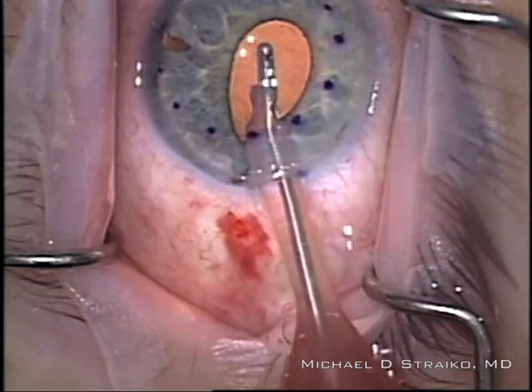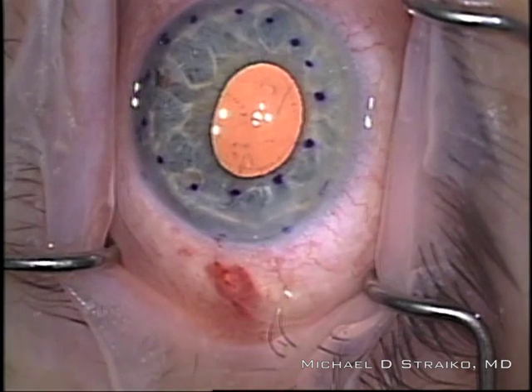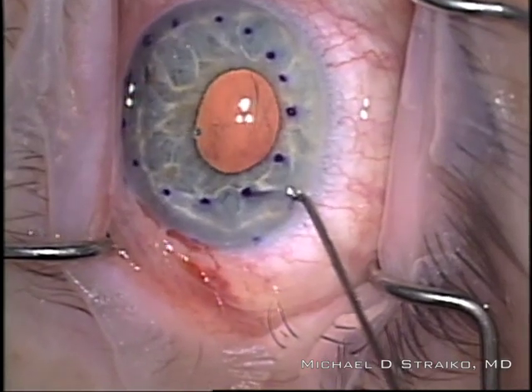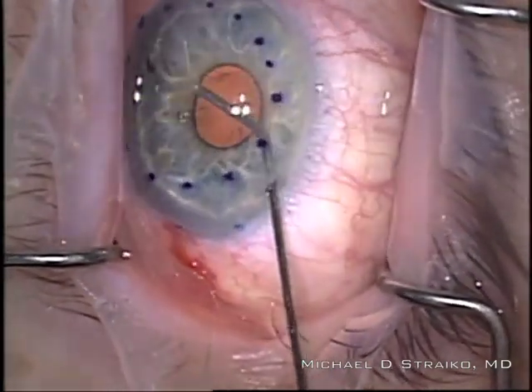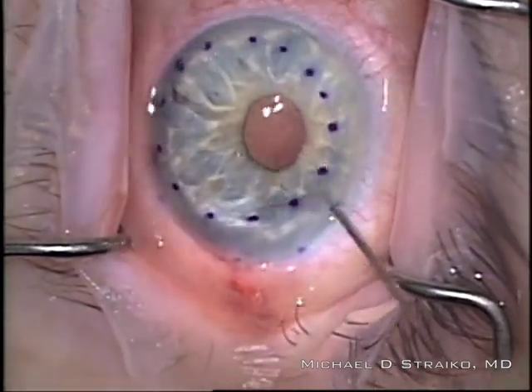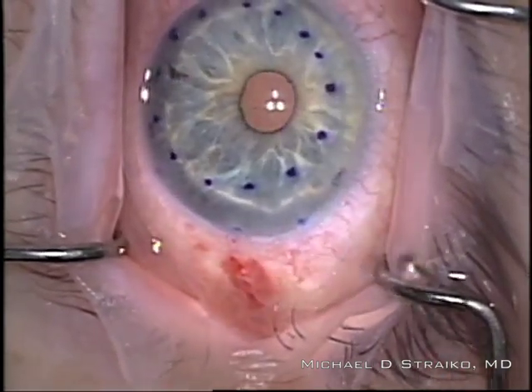Now I'm using irrigation-aspiration to make sure that there's absolutely no cohesive viscoelastic left in the eye. I'm going to inject a little Myochol here to bring the pupil down, because I want the iris to protect the graft from the intraocular lens. I'm just gently stroking the iris to help bring down the pupil and getting that little air bubble out of there.